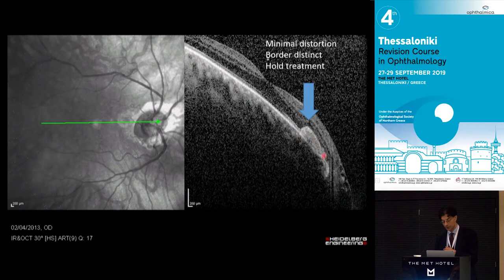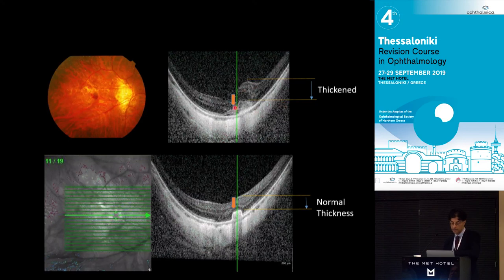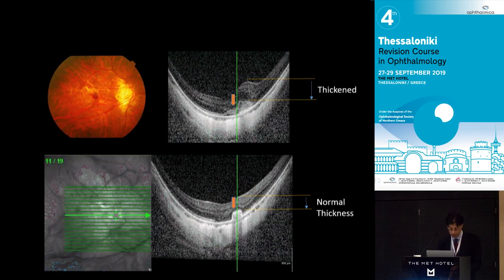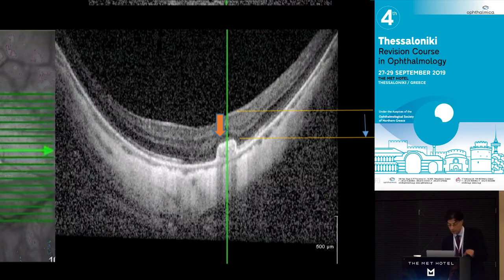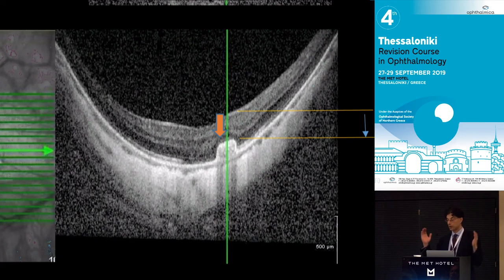Here's another example: a patient who initially had subretinal hyperreflective material, didn't want injections, then the retina thickened, vision declined, and they got treated. The endpoint of treatment is the RPE growing above the CNV complex with a really well-defined border — it will not go away but just sits there. Sometimes with luck your ellipsoid zone will reform above it and you can have pretty good vision, though there will still be distortion. That is your endpoint there. In terms of type 2 CNVs, they look quite different in young patients — very subtle and small in myopic membranes. A dense raster scan is needed. I find it very difficult to manage type 2 CNVs without very high-quality OCT, because seeing the change in fuzziness of the border requires an OCT that tracks properly.